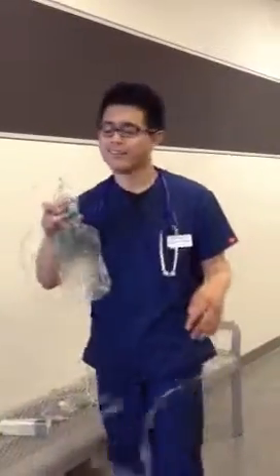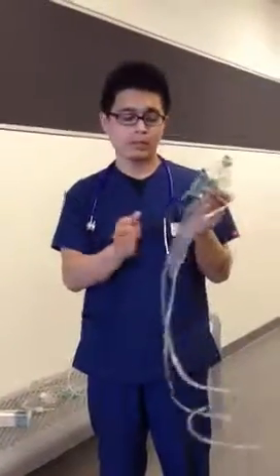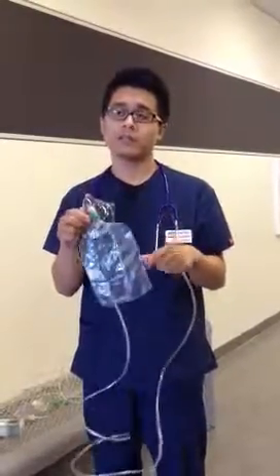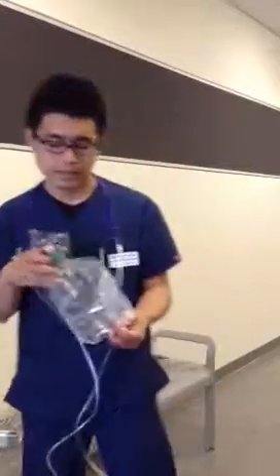Now, the difference of this mask compared to the other mask is the reservoir bag. With this reservoir bag, you want to make sure that the bag is moving as the patient is inhaling. As it inhales, you want it to deflate to maybe half or a third of the bag. Now, if it's staying inflated, that means it's too much flow, and you have to decrease the flow. If it's completely collapsing, you need more flow, and you increase it.